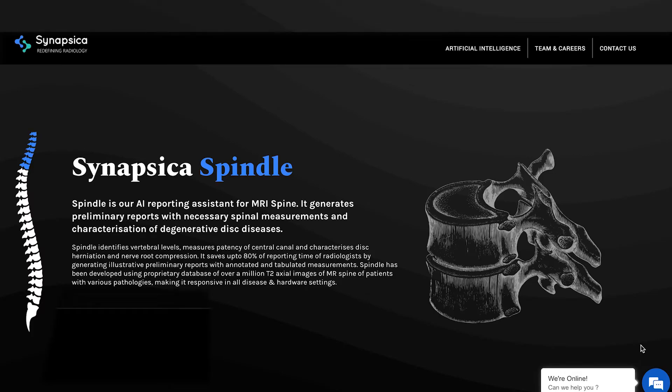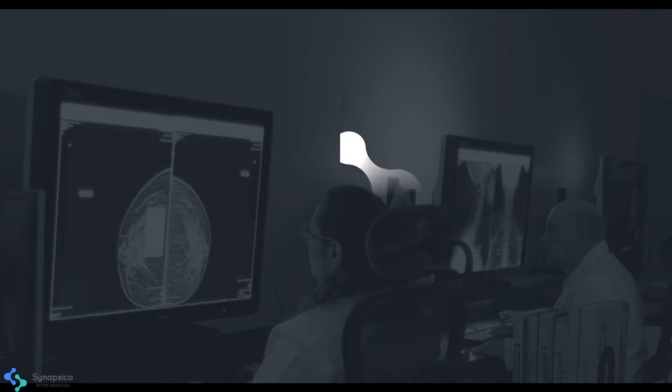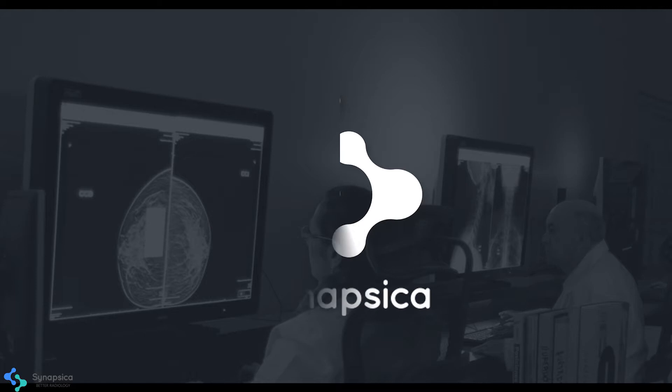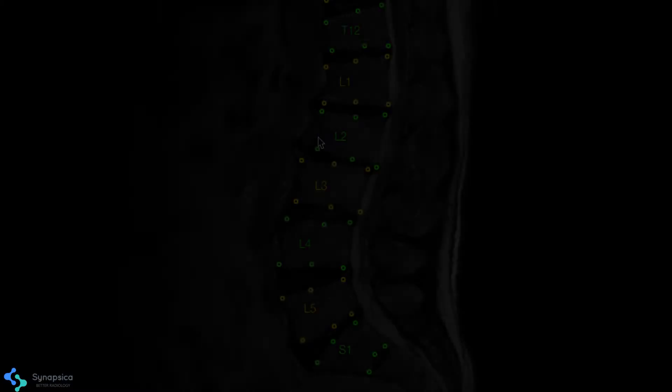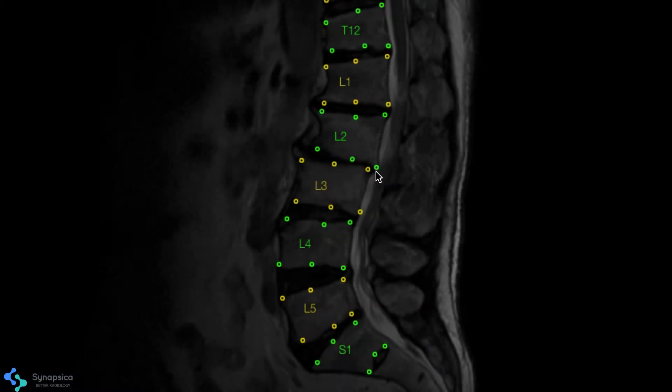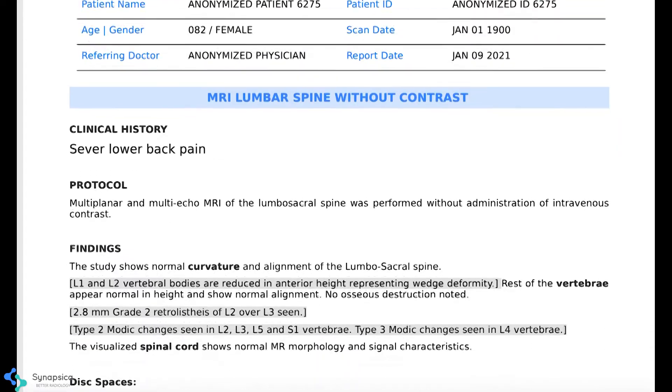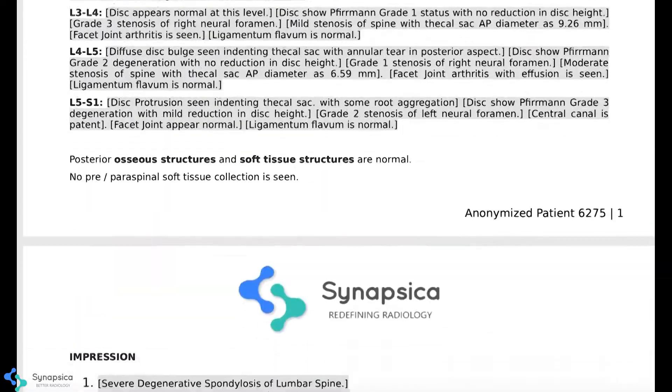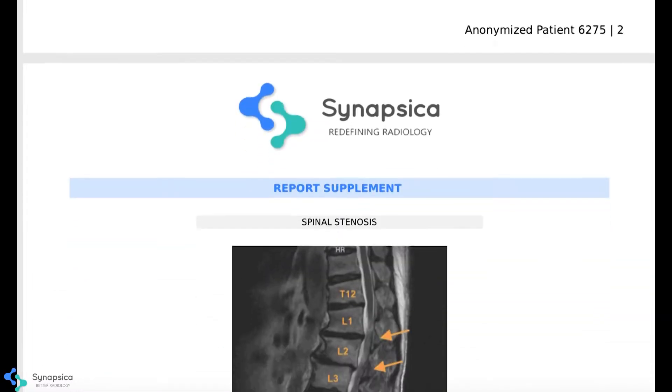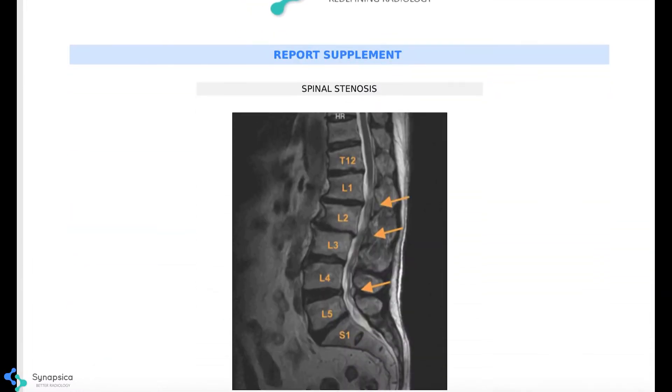Hi, let me introduce Spindle by Synapsica, an intelligent AI reporting assistant for MRI spine. Spindle automatically identifies degeneration in the spine and produces a preliminary report with qualitative and quantitative evidence of disease.